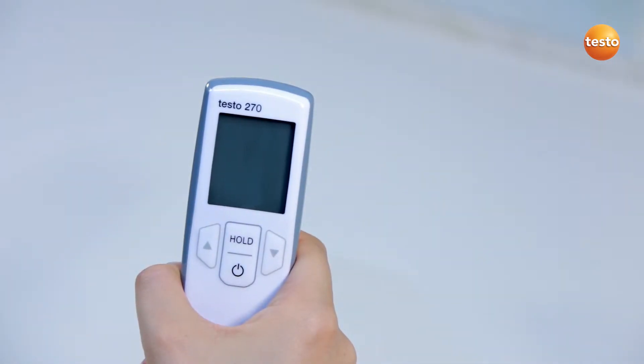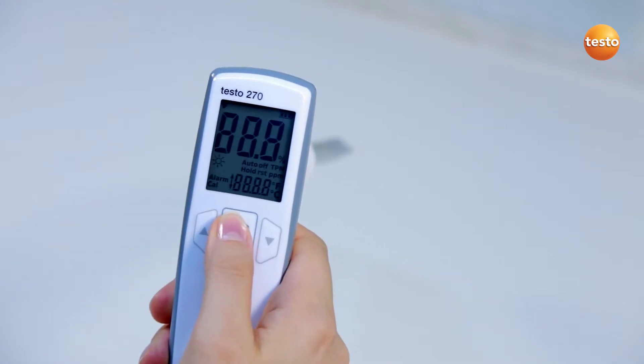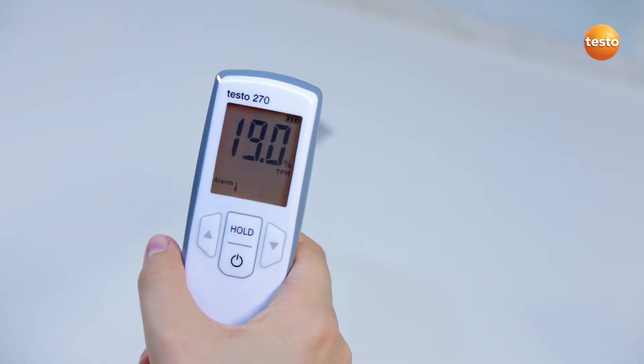In order to configure the Testo 270, I switch it on and immediately press the hold button for 2 seconds to access the configuration menu.